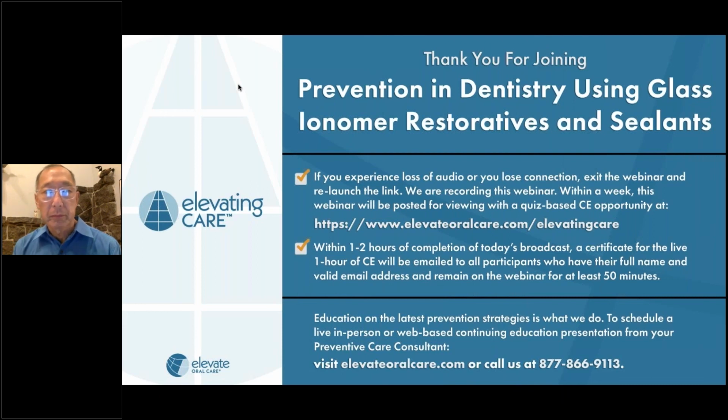The last question, for either of you: after placing a glass ionomer restoration, is it acceptable to immediately apply the unfilled resin and light cure to prevent water loss and or contamination? That is acceptable. That is what we use as a coating.